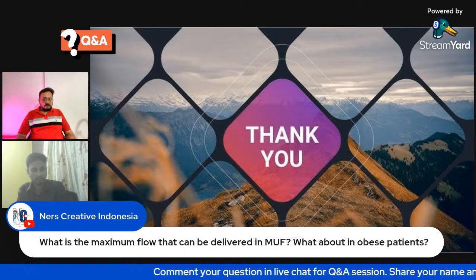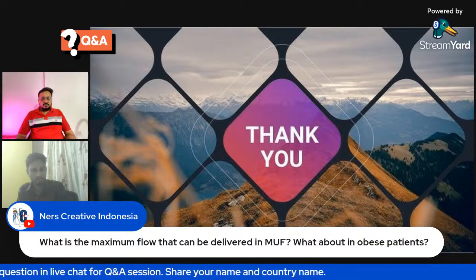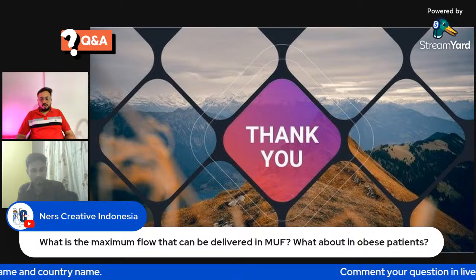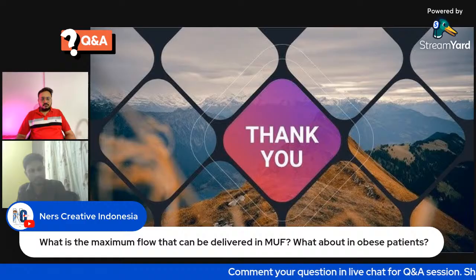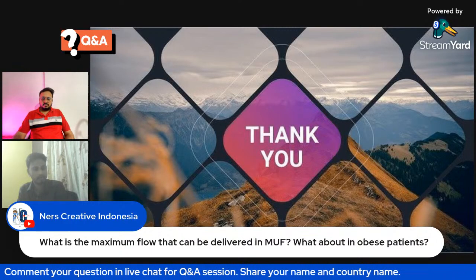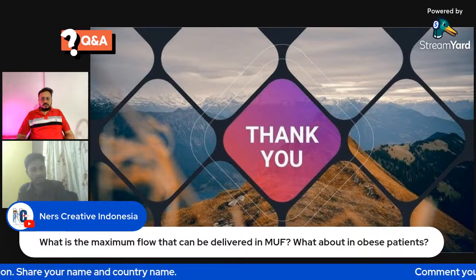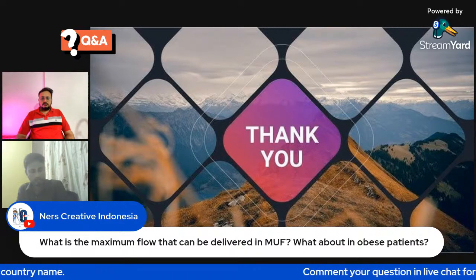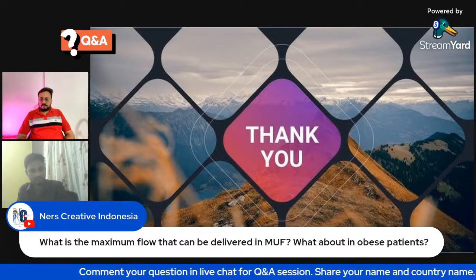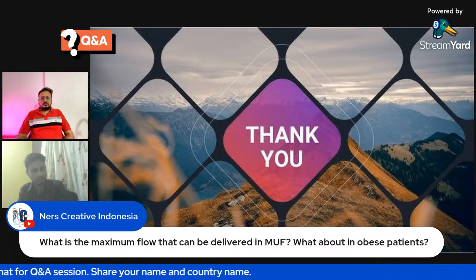Okay, so we have one more question. It's from Indonesia. What is the maximum flow that can be delivered in MUF? What about in obese patients? For all patients we use the standard protocol, 15 to 20 ml per kg per minute, as the maximum MUF flow. If it is greater than 20 ml per kg, it can cause cerebral edema. It also depends on the arterial line pressure. If the arterial line pressure is good, we can increase the MUF flow.